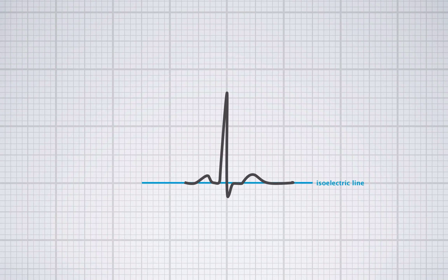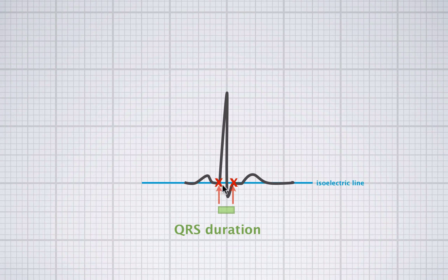Finally, let's talk about the duration of the QRS complex. Here you can see a normal QRS complex — it starts here and ends here. The duration of the QRS complex is about two and a half millimeters long. Two and a half times 0.04 is 0.1 seconds, and the normal duration of the QRS complex is 0.1 seconds or below. So we have a normal QRS duration in this case.